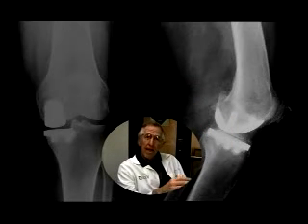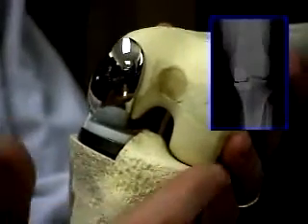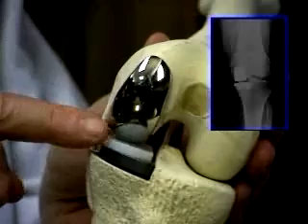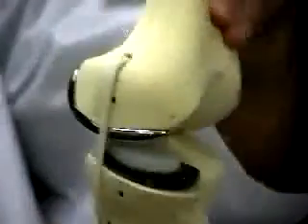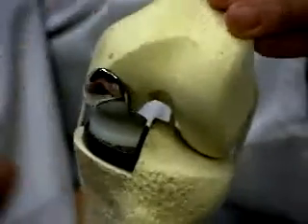So let's just play with this and see what this looks like technically. Okay, so what we're showing here on this sawbones, this is the medial compartment, this is the lateral compartment, and the kneecap has been taken off. So what this represents is the partial knee replacement. So here's the femoral component on the femur, then there's metal here, and then there's plastic right here. So this is what you see. This is a partial knee replacement, medial compartment. There's lateral, and that's how it moves. So that, as you can see, the morbidity is much less than for a full knee replacement.